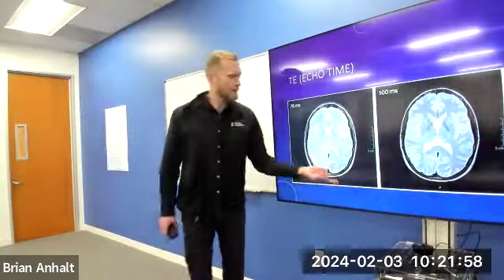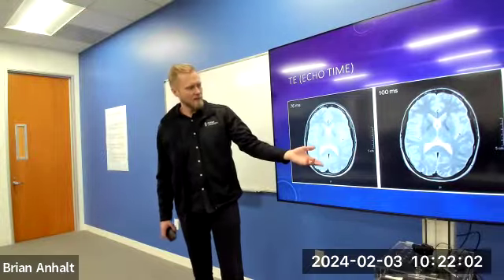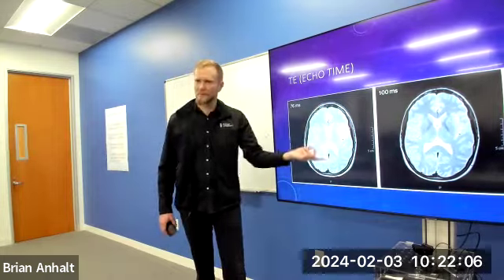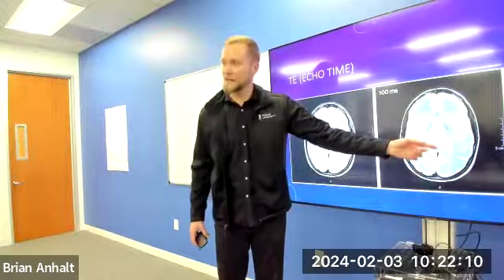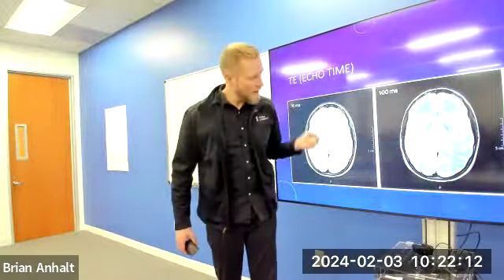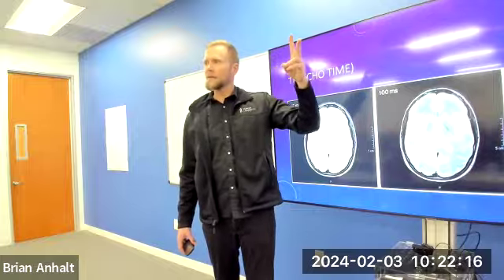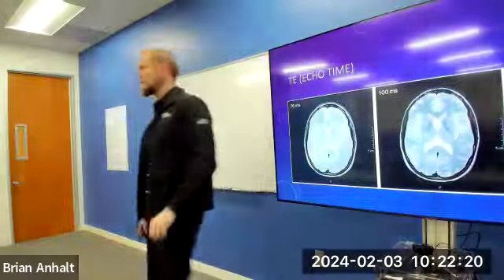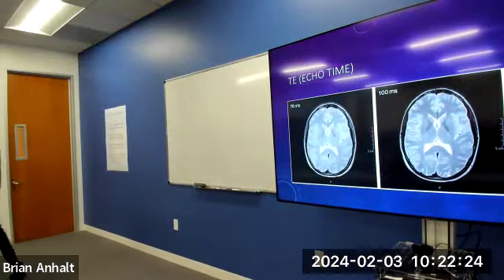Look at over here. Smooth, lots of signal. I see no grain. I see no noise. Kind of weak contrast though, right? Everything kind of looks similar. I don't have a lot of differences in tissues. Starting to see it here, right? We increased our TE to give us better what? T2 contrast, but what are we sacrificing? Signal, right? Another trade-off.